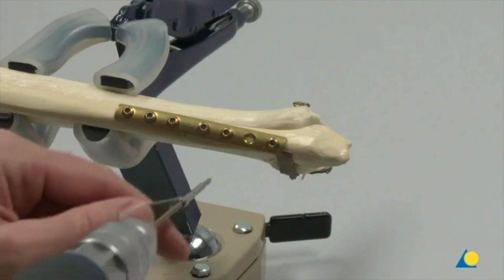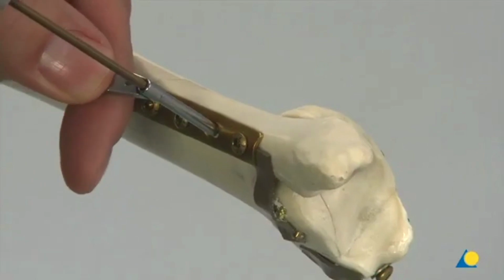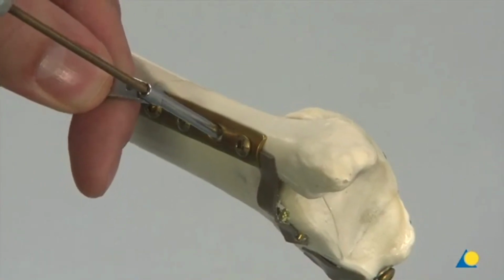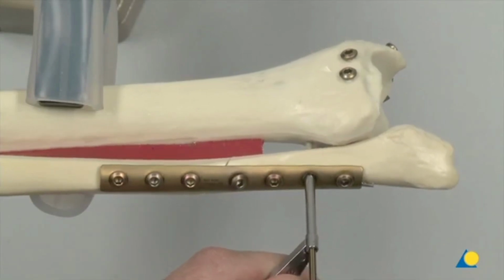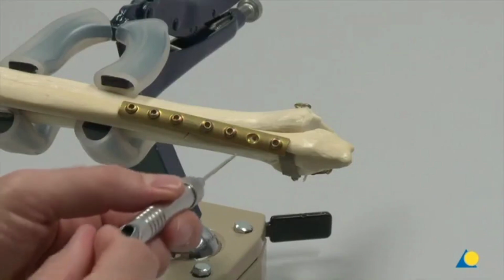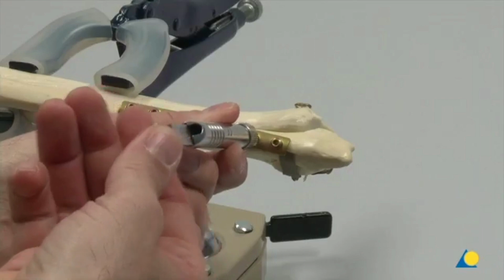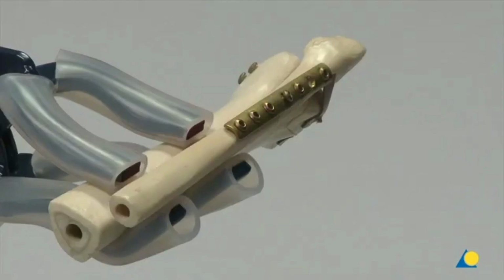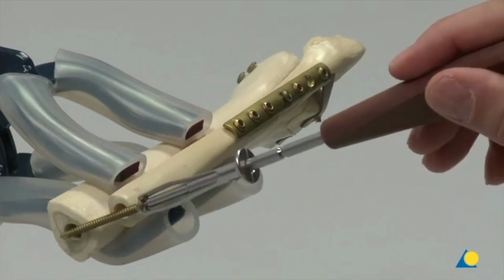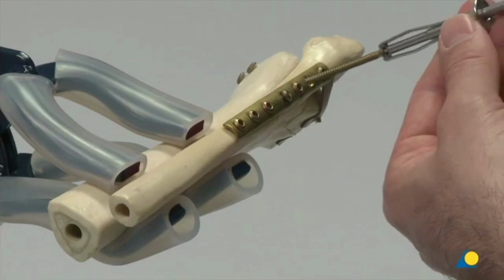Using the 2.5 mm drill bit and the appropriate drill sleeve, the 3 cortices are drilled at a 30-degree anterior angle and parallel to the tibial plafond. The depth gauge is used to measure the required length of the screw. A screw of about 36 mm will generally be long enough. A 3.5 mm self-tapping cortex positioning syndesmotic screw is inserted using the hexagonal screwdriver.